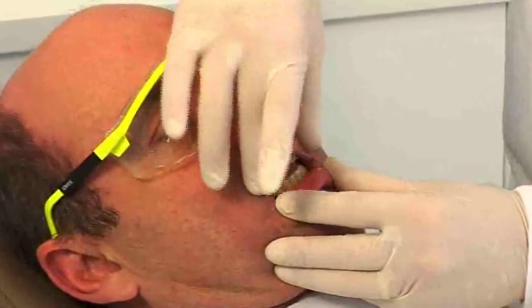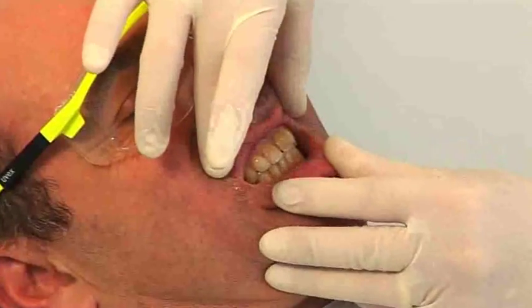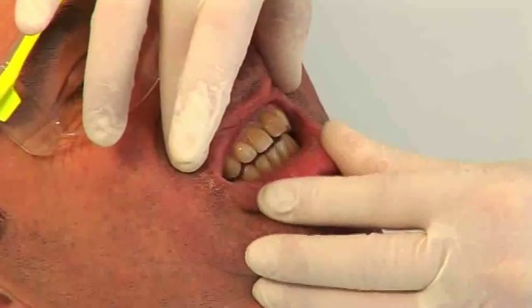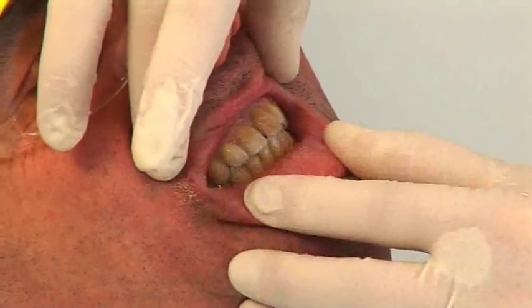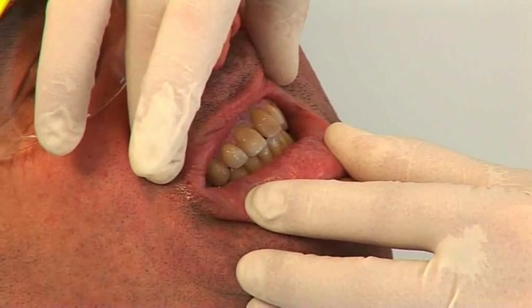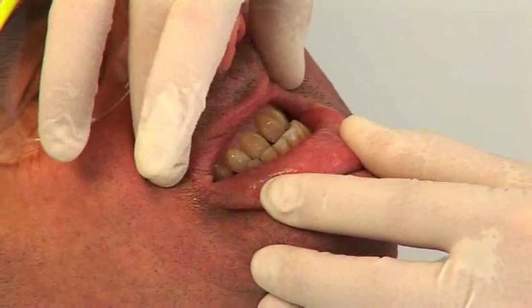Simon, I'd like you to bite together as you normally bite. Just tap together a couple of times, get a feel of that. Now slide your lower jaw forward. Keep going as far as you can go.